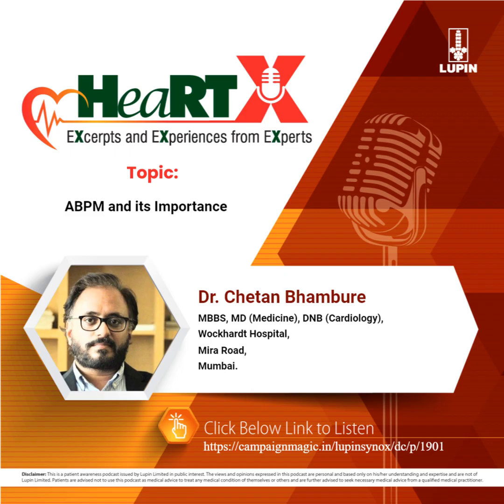I'm going to be talking about ABPM and its importance. ABPM is ambulatory blood pressure monitoring, which provides a 24-hour account of the patient's state and is useful for diagnosing primary and secondary hypertension and differentiating it from the white coat and masked subtypes. It is accurate in predicting the risk of cardiovascular disease and mortality.